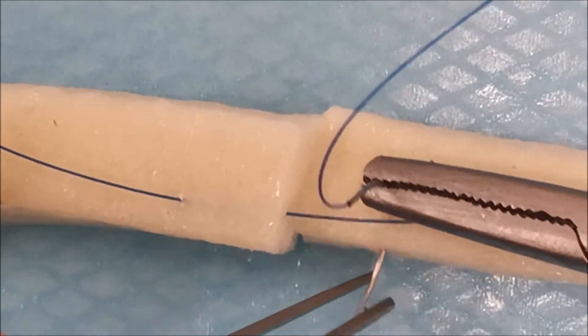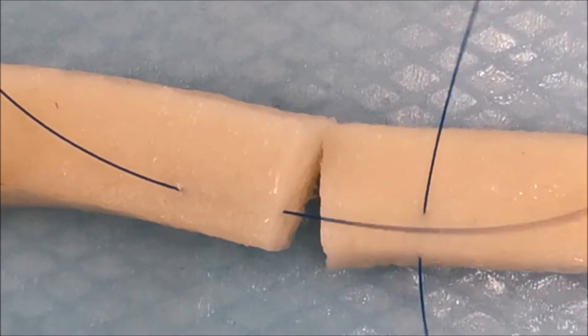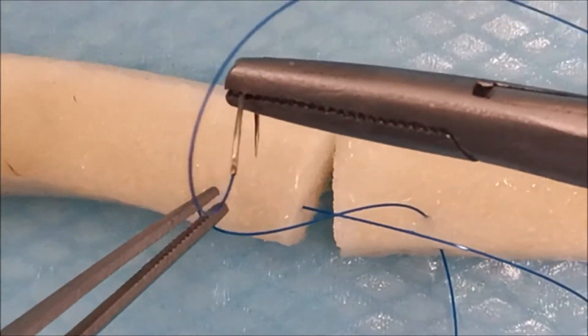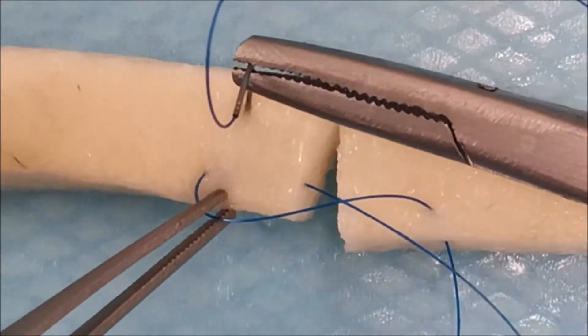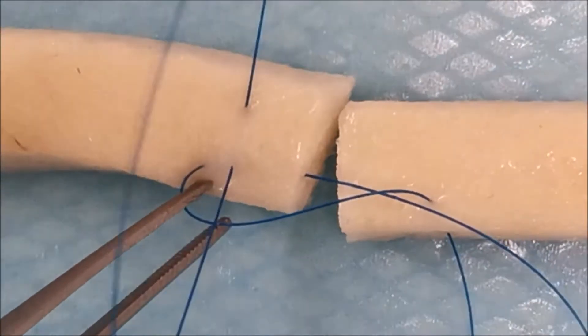The epitendinous suture is small bites on the epitendon, ensuring you don't go deep enough to go through your core suture. You're taking bites towards yourself. Each subsequent bite is going further away from yourself.